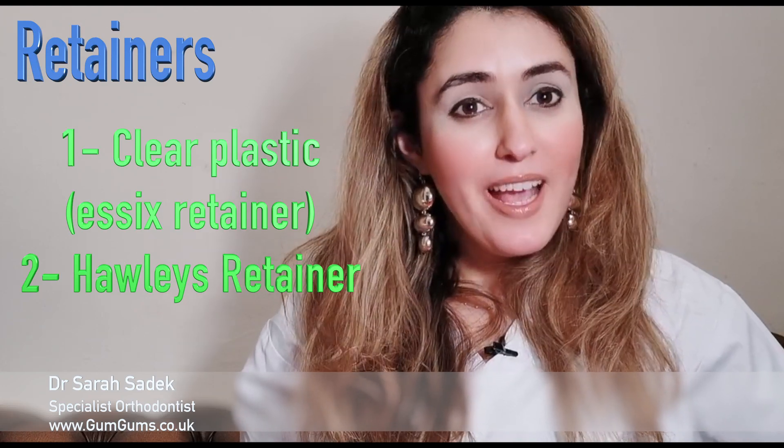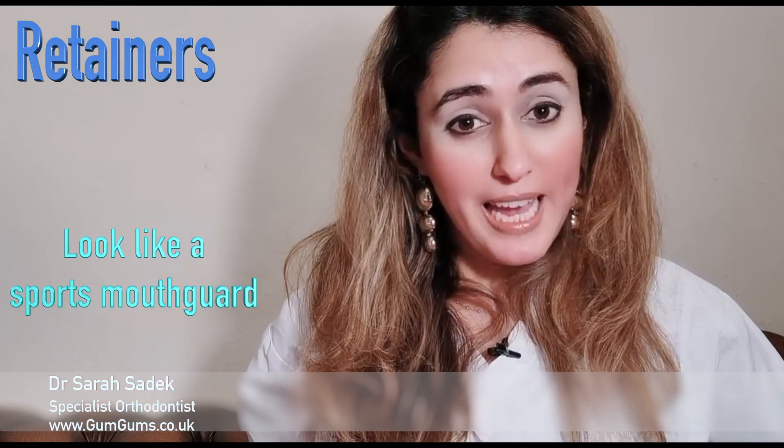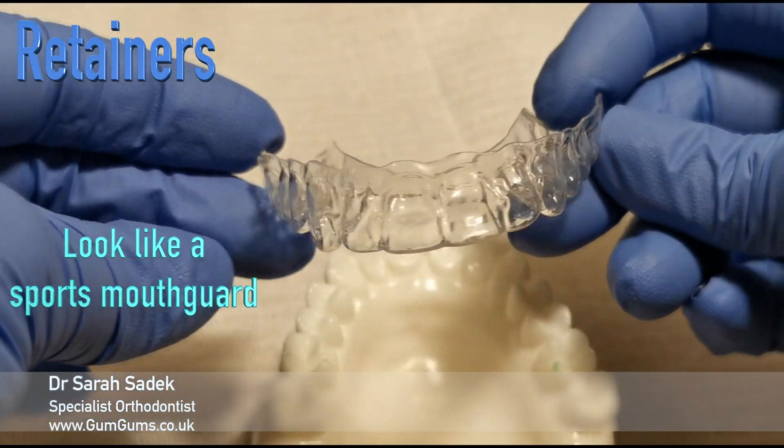Removable retainers come in two types. The first is a thin, clear and discreet one, which we call an Essex retainer, that looks like these. These are the more common types of retainers that your orthodontist will provide, and they look similar to a thin sports mouth guard.